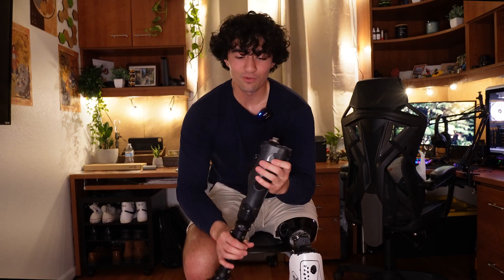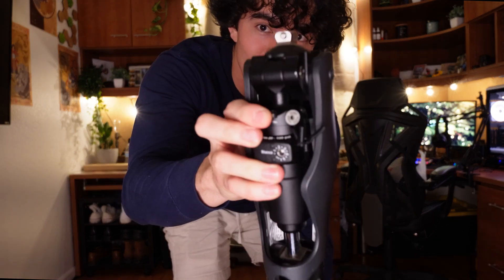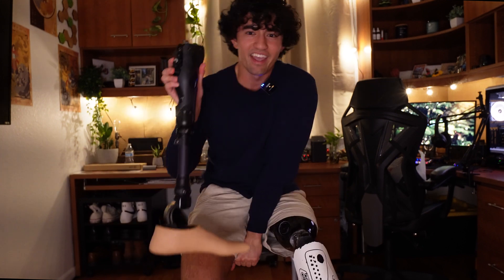This prosthetic was great — you could run on it, swim in it, it was waterproof, and did everything I needed. But the hydraulic on this one is an air hydraulic. Every week, because my prosthetic was busted, I had to pump air into it using a little pump. More air makes it swing out faster, but my air pump storage would break, so the air wouldn't stay in. It would swing so slowly I'd have to throw my whole body into it, sweating every single step.